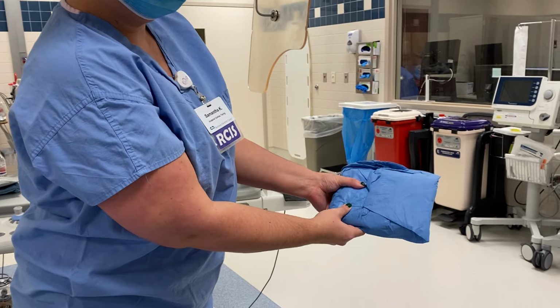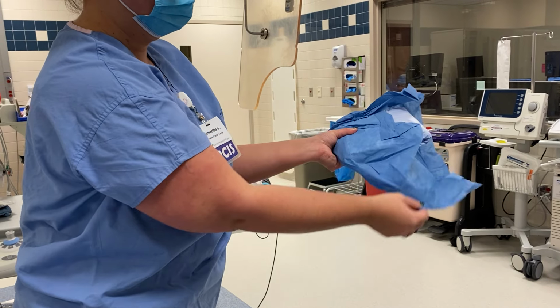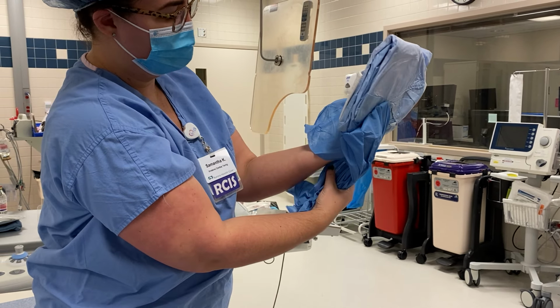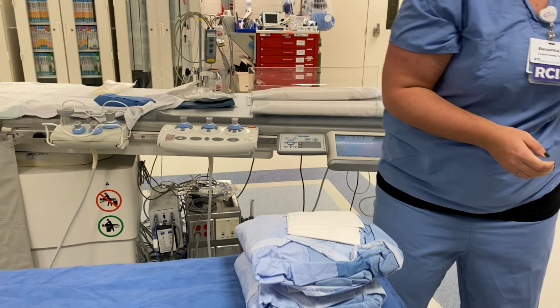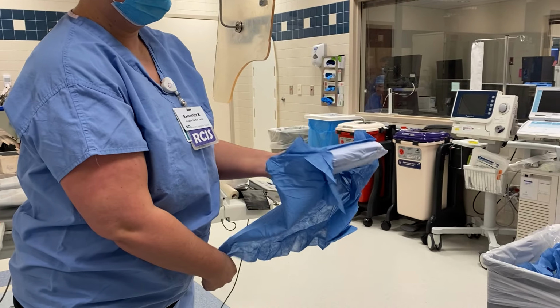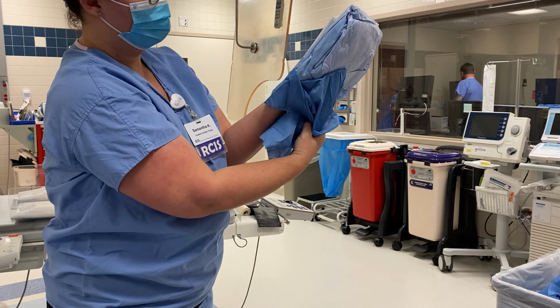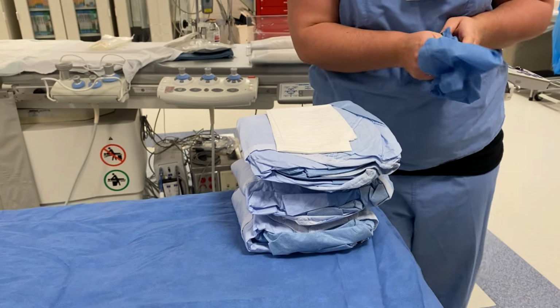So again, thumb goes under, peel away, and then pull towards me. Gather everything up without touching the actual gown, setting it right on top. Again, I pulled it away from me, and then out to the sides. Pull this one back, just like that.